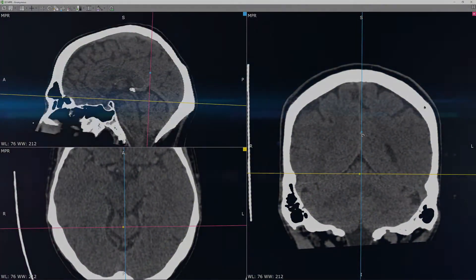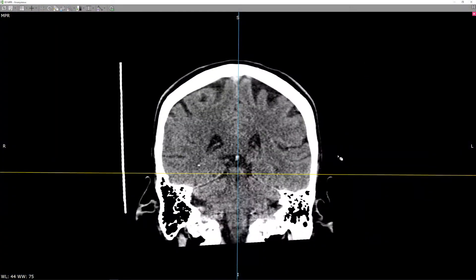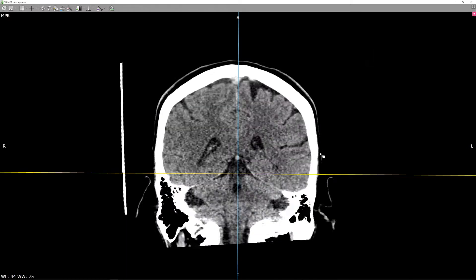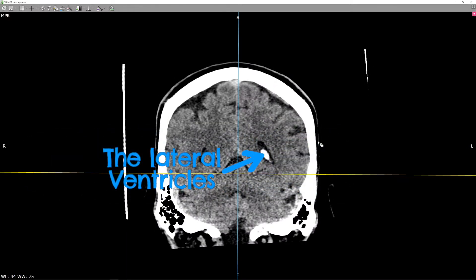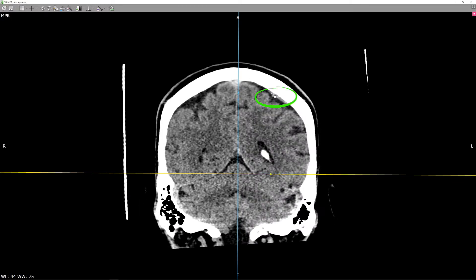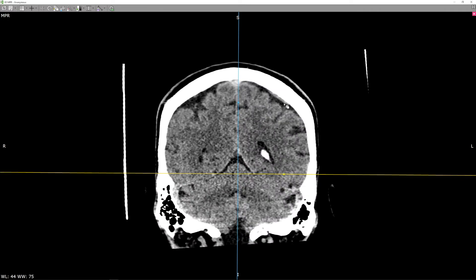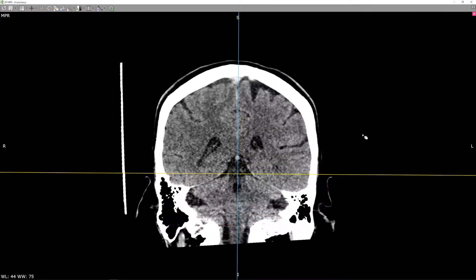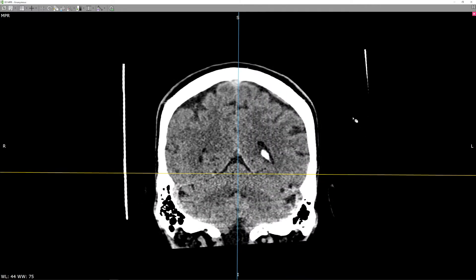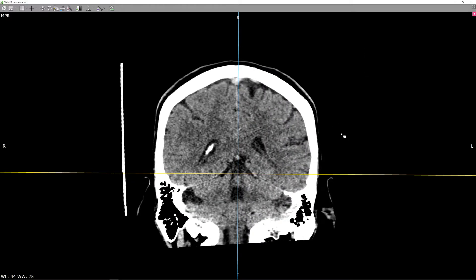Let's move on to the coronal plane. This plane is particularly useful for looking for subtle collections, be that blood, pus, or fluid. As you can easily see these structures here representing cortical veins — if there was a collection, these veins would be pushed away from the bone, and therefore make it easier to assess acute hemorrhage.